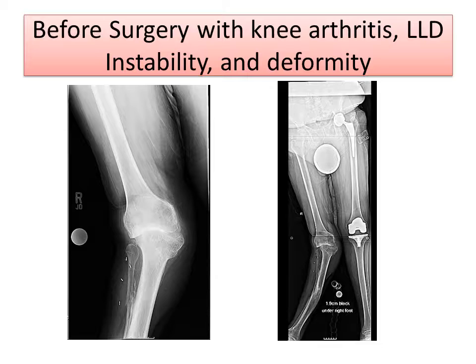These are x-rays prior to surgery. On the left, you see the knee with deformity and instability, and on the right side, you can see the deformity represented by the angle between these two red lines, and the shortening.